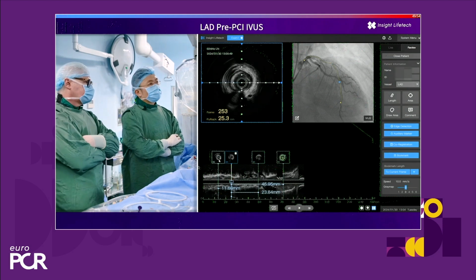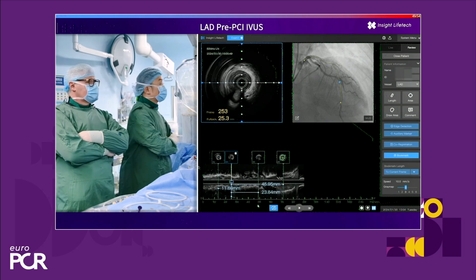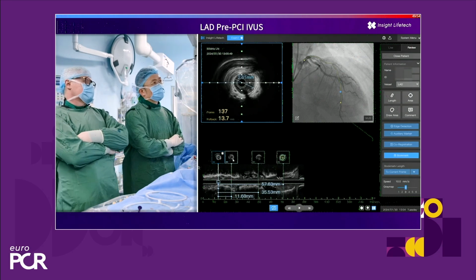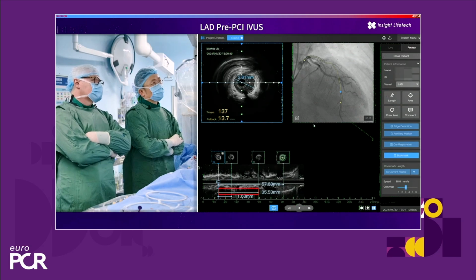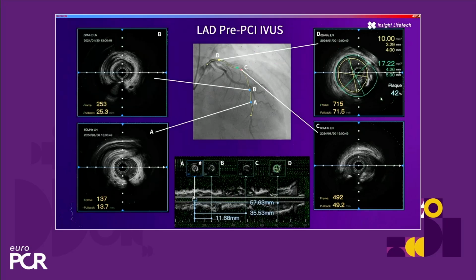Measure the length from the first stent to the distal diagonal, how many millimeters? Let's do a 2.5 20 pre-dilatation. So the distal landing zone to this one is length is 35. Now we see some measurements, and we also measure the length, which is possible with this system using automated pullback. So definitely distally to the diagonal branch there is quite a long segment. It's close to 4 centimeters, but all along the vessel it is much more, of course.